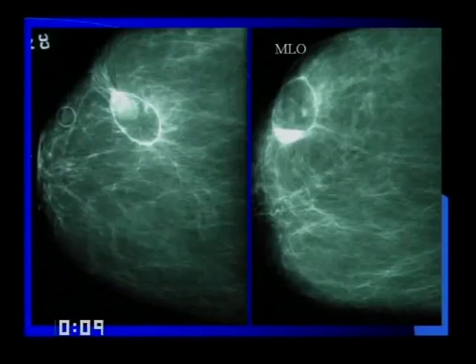And this is another fat-containing lesion. What is this? Anybody? Galactocele. This is an oil cyst with a fat level here. This was a hematoma following a car accident that developed subsequently into an oil cyst.